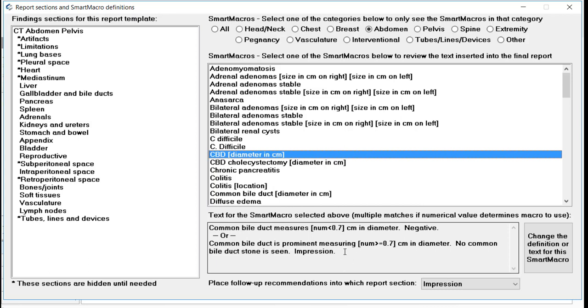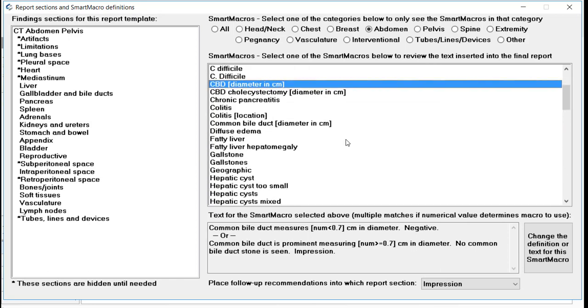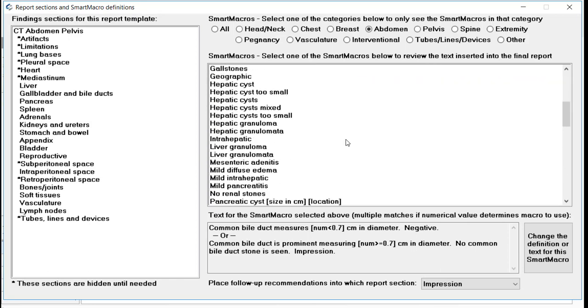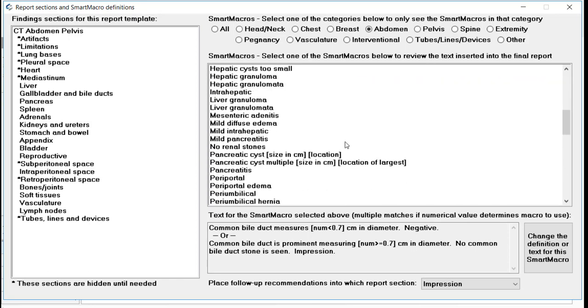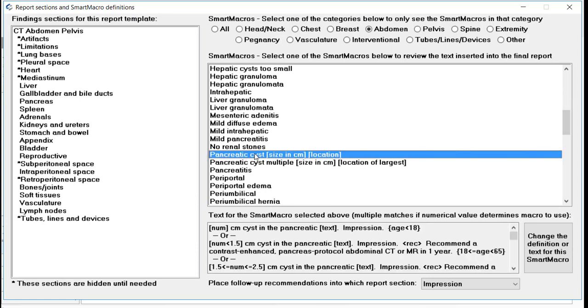If there was a stone present on the images, you would not use this macro but instead simply dictate the finding. There is also a smart macro for pancreatic cyst or multiple pancreatic cysts. If we select this smart macro, there are several different text results depending on patient age and size of the cyst. Simply use the macro as described here and R-Scripter will take care of inserting the proper text. If the cyst is atypical in any way, you would not use this macro and simply dictate the appropriate finding.